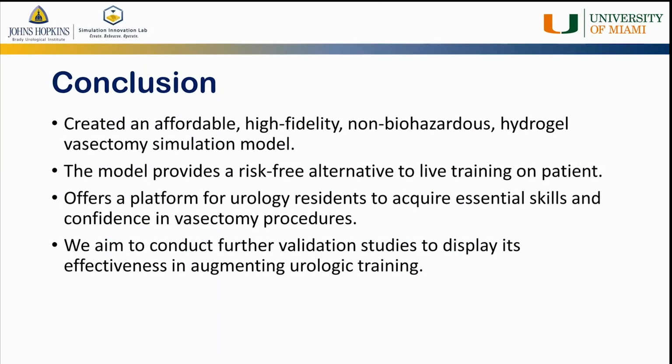In conclusion, we created an affordable, high-fidelity, non-biohazardous hydrogel vasectomy simulation model. Although it is in its early stages, the model provides a risk-free alternative to live training on patients for urology residents that allows them to acquire the essential skills and confidence to perform a vasectomy procedure. Ultimately, we aim to conduct further validation studies to display its effectiveness in augmenting urologic training.